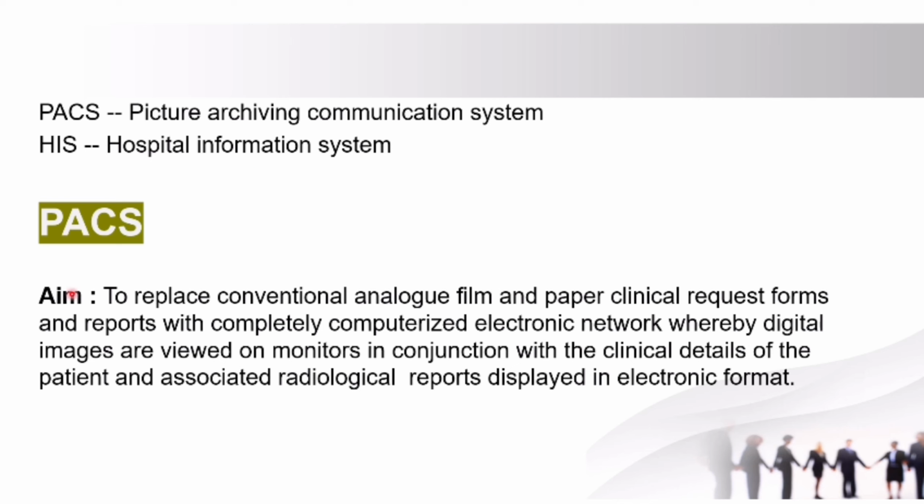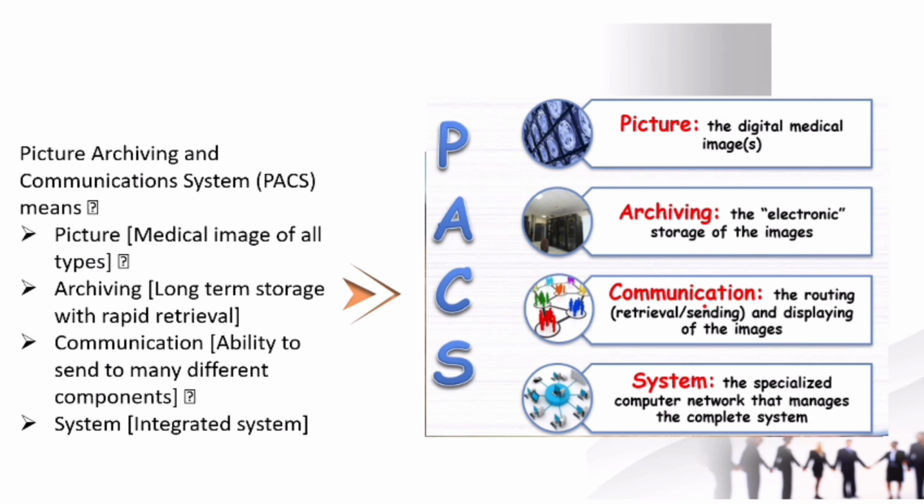The aim of PACS is to replace conventional analog film, the paper clinical request forms that we give to the patient, and the reports with a completely computerized electronic network, whereby digital images are viewed on monitors in conjunction with the clinical details of the patient and associated radiological reports, which are all displayed in electronic format. Now we will elaborate on each word of PACS.